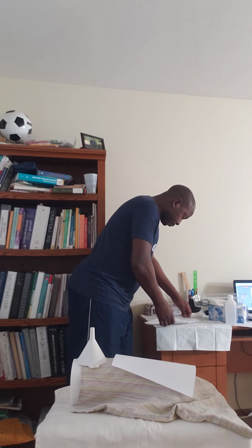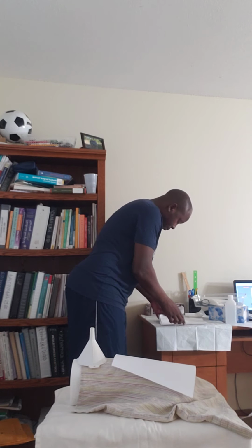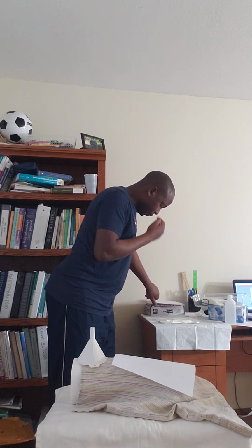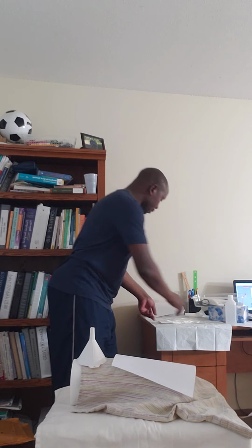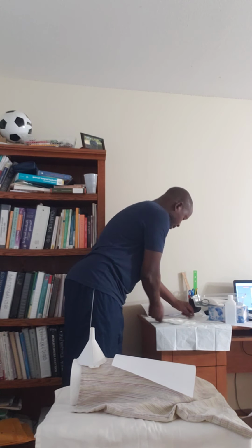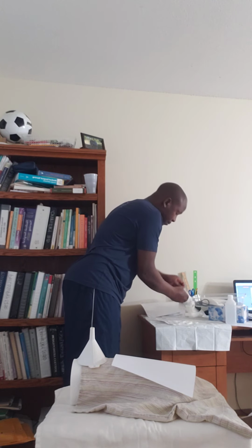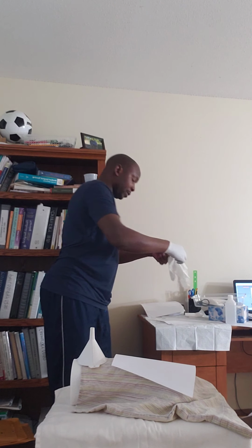So this is my gloves. In the middle, remove as I said, to avoid cross contamination. Don't jump to that one when you open the gloves. Then you come this way. Don't touch the gloves in the middle.